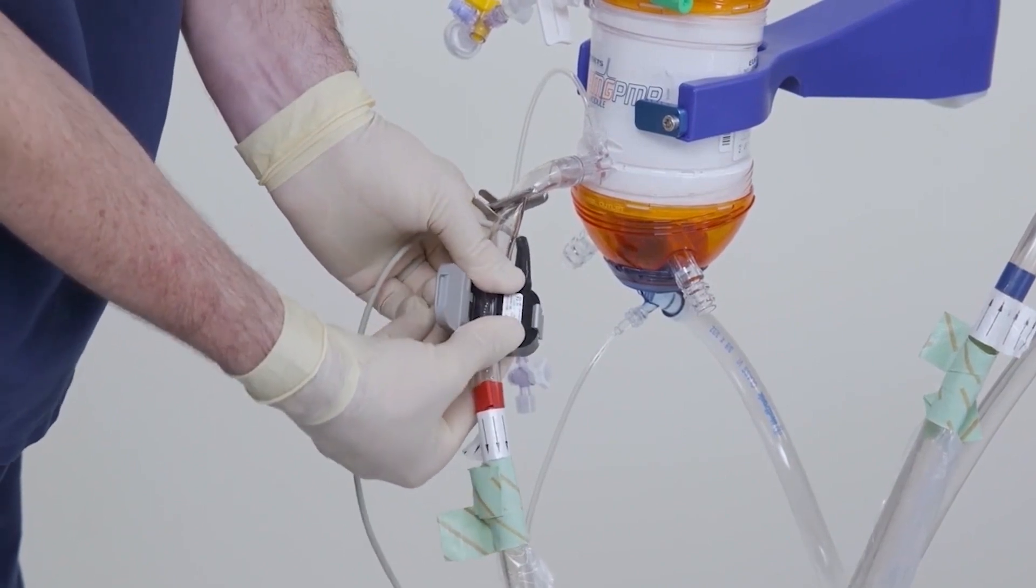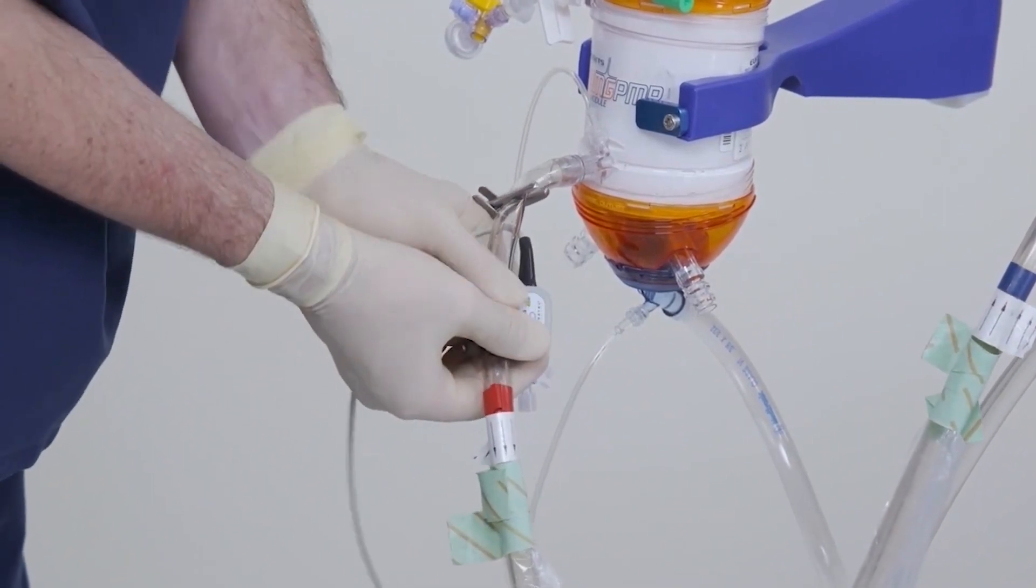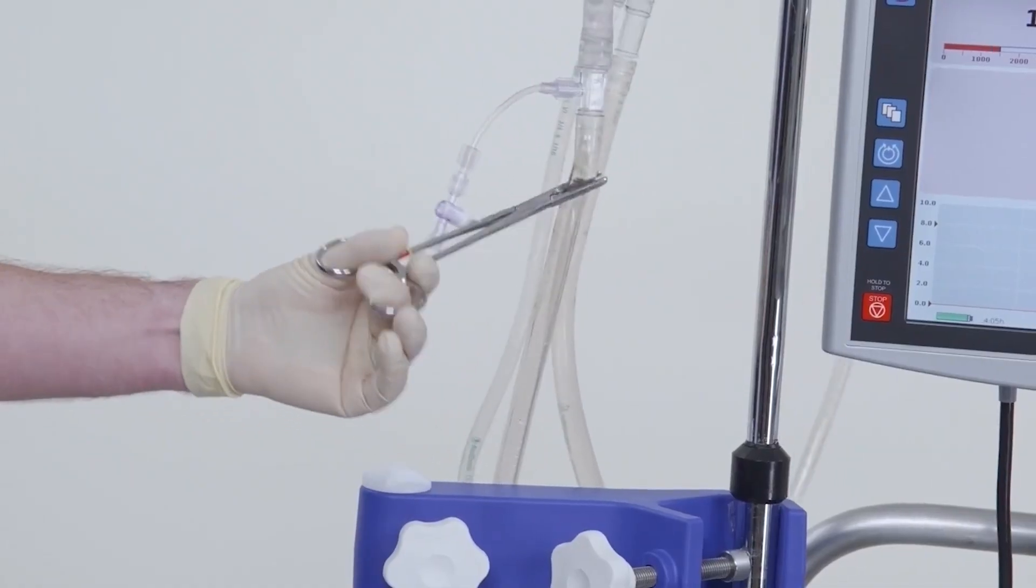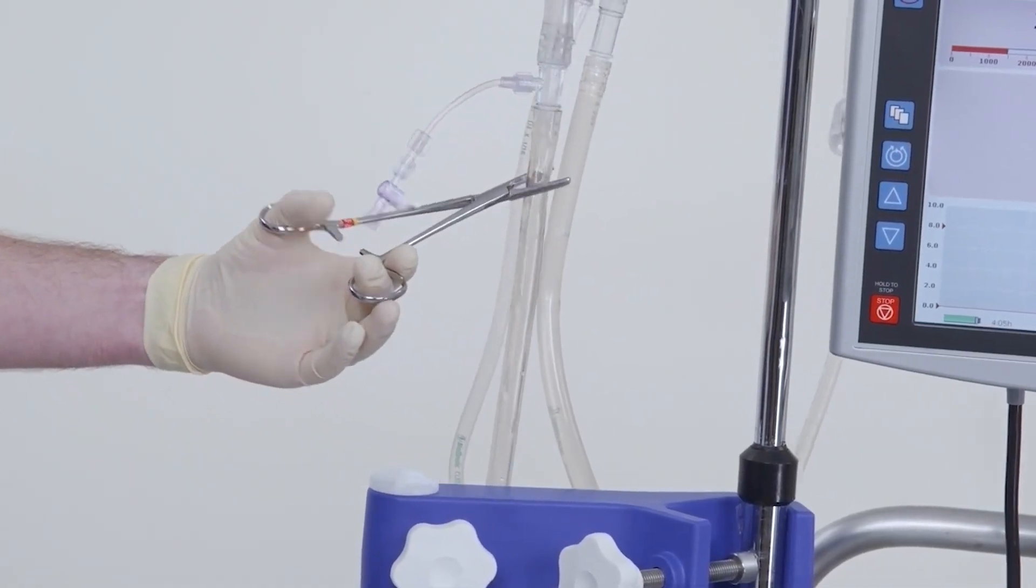Then place the CentraMag flow probe on the outlet tubing of the oxygenator. Next, remove both tubing clamps from the oxygenator outlet line to prime the rest of the circuit.